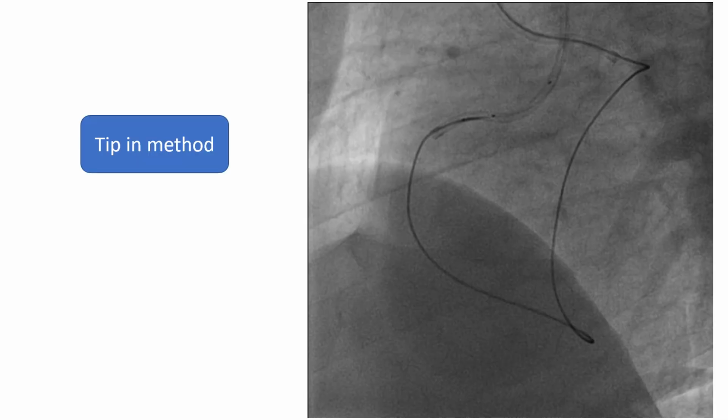To do that, we have to push the microcatheter all the way to the proximal vessel and preferably to the antegrade catheter. You can see here we pushed it up to the antegrade catheter. This is not always possible as it needs great support, and in this case we needed to anchor the wire of the retrograde catheter by balloon in the antegrade catheter.